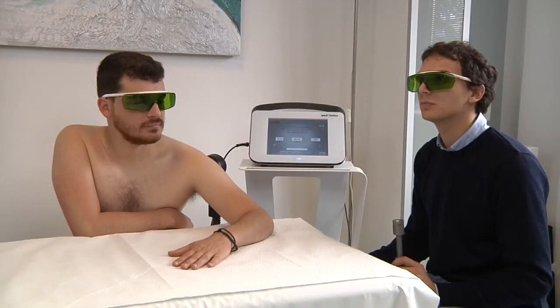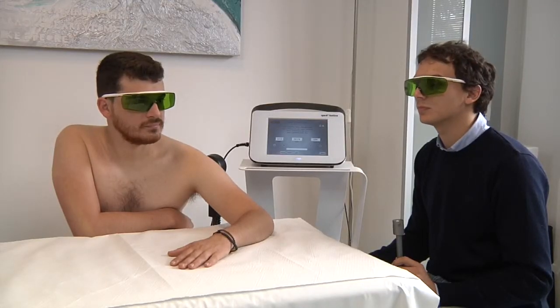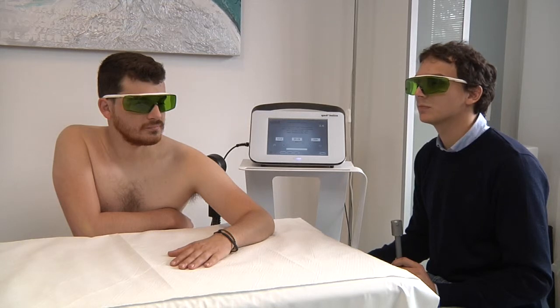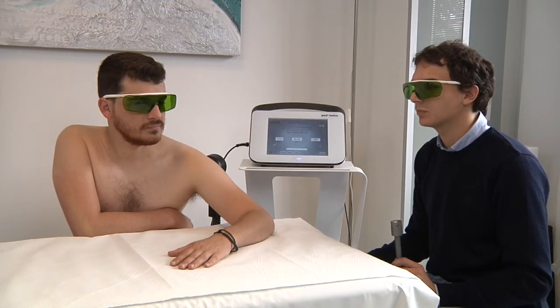For the first phase of treatment, we select a program in the pulsed mode with fixed frequency. We have already applied the small spacer. We will have to perform a slow movement along the treatment area that goes from the proximal third of the forearm to the distal third of the arm.